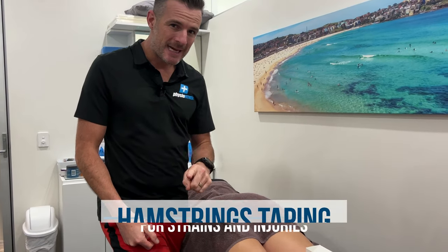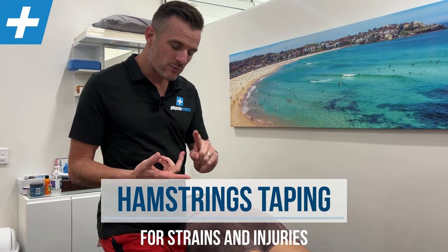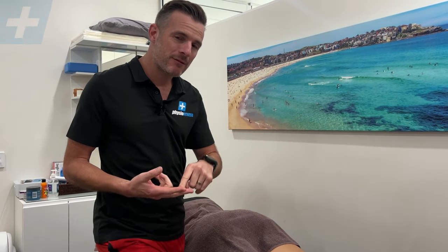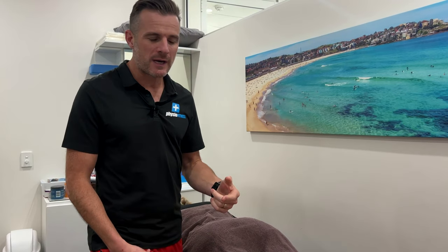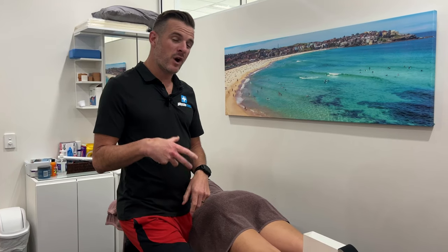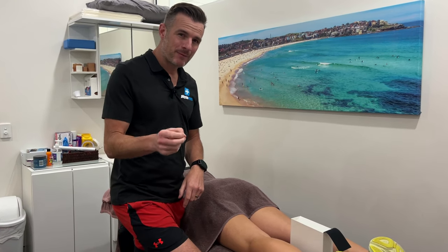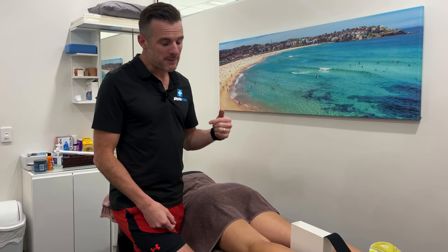Today is another taping session and this time is for your hamstrings. We're going to do K-taping or kinesio taping for the hamstrings for people who have got tight hamstrings or recovering from a tear and they're returning to sport. This is for people who are training or going to training — they need a little bit more help with the taping to get them through training so it stops tightening up. It's also really good for people who have old tears that have been rehabbed and repaired, and they're just not quite 100% but they need to start training.